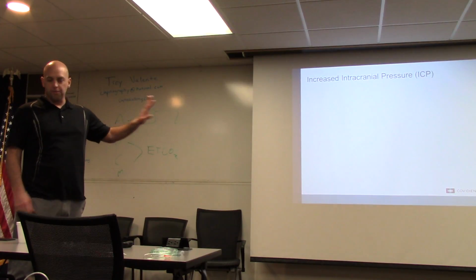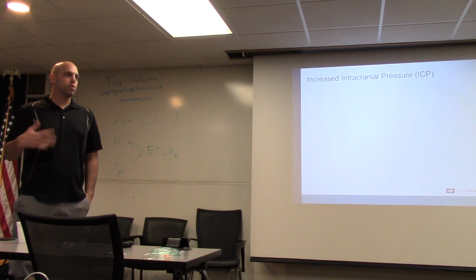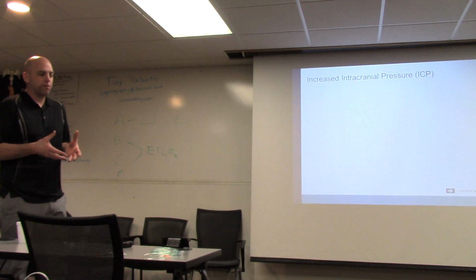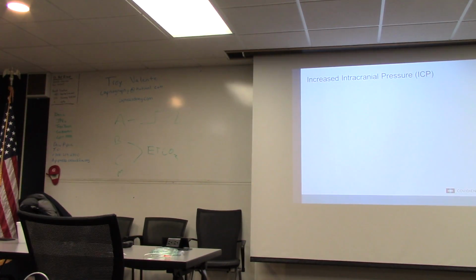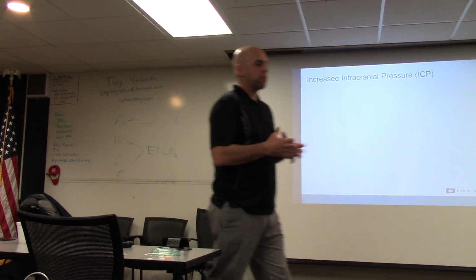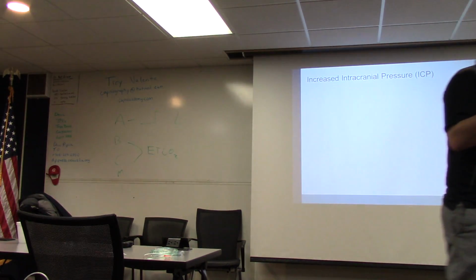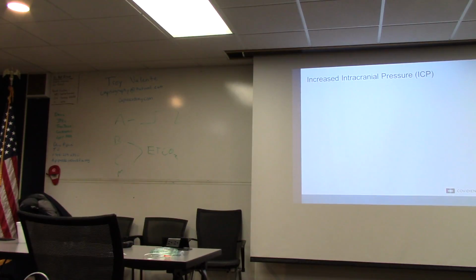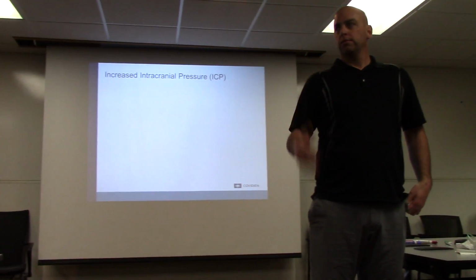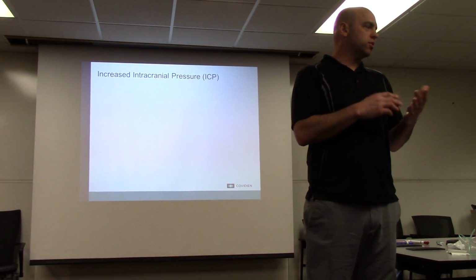Would we have been able to have the entire discussion we just had about perfusion thresholds and considerations to increase that? No, because you would artificially inflate the end tidal CO2 by hypoventilating the patient, even though you don't do anything to change the perfusion or metabolic box. Or if we were to teach someone, if it's high, hyperventilate them. Well, number one, you're hyperventilating a patient, which is a big no-no. Number two, what does ROSC do to your end tidal CO2? Spikes it. So now we're trying to breathe off ROSC and we miss ROSC.